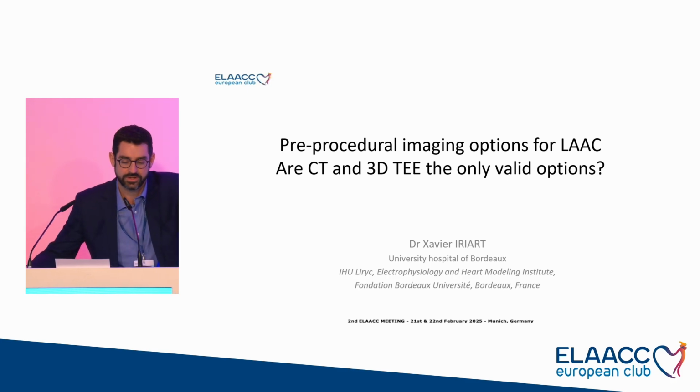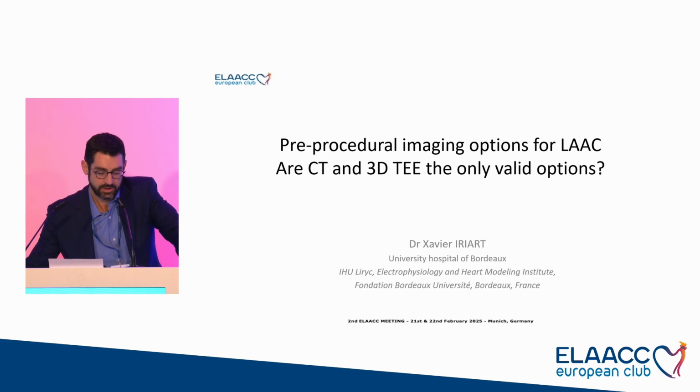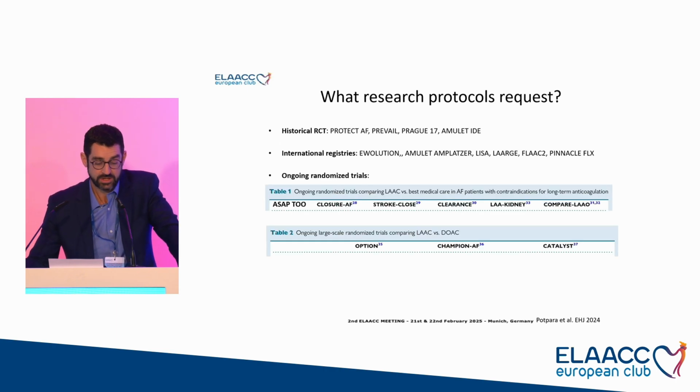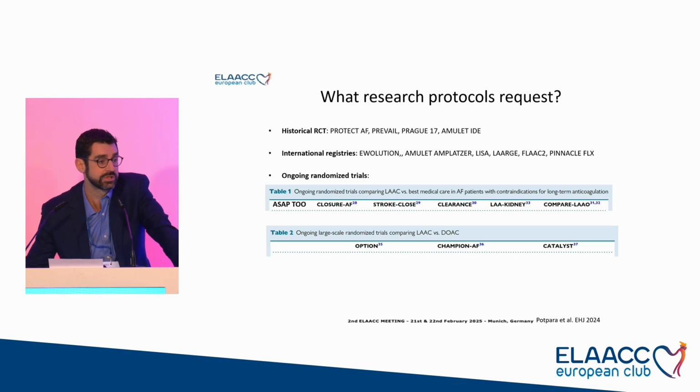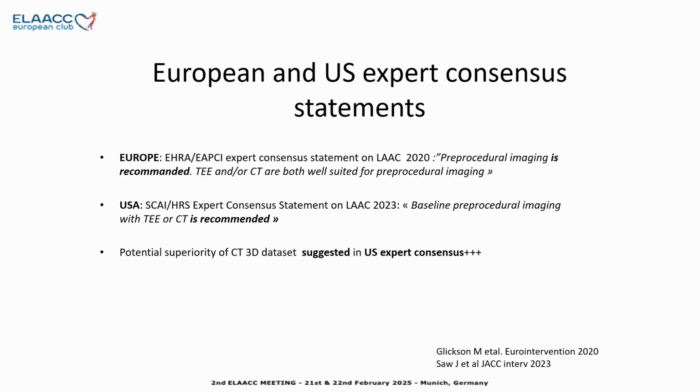All right, thank you for the introduction and good morning, everyone. So in this first presentation focused on pre-procedural imaging, I will try to answer the following question: are CT and 3D TOE the only valid options? So to answer this question, I first looked into the historical randomized controlled trials and the international registries, and I also looked into the ongoing randomized trials, and I think the answer is clear here. There is no 3D imaging modality required to include the patients in these trials.